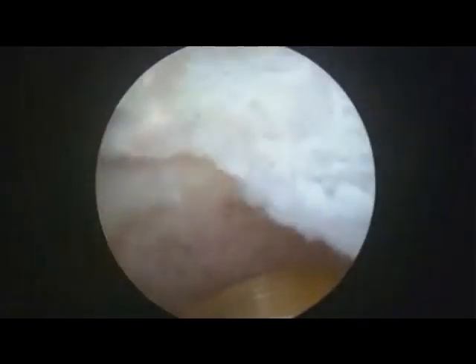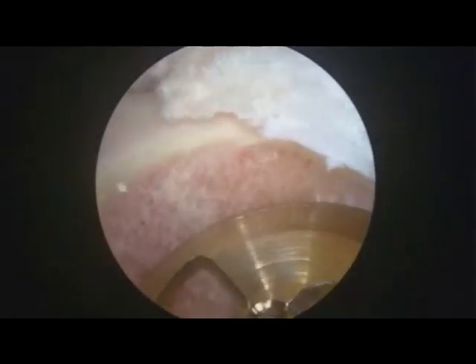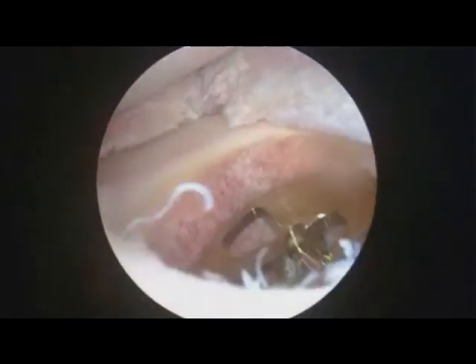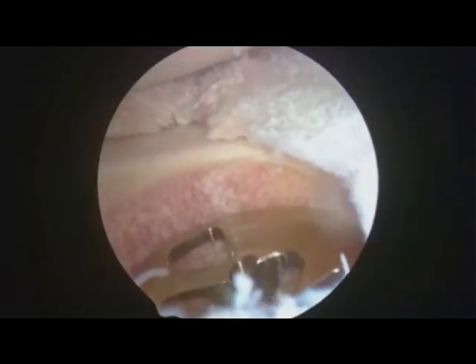You can see the meniscus is just a little bit frayed, but it's still intact, and the whole purpose of this procedure is to be meniscus sparing, so you don't want to take any of that down at this point in time. Now, it's up to you if you want to put the final implant in now or not. I'm just going to show it to you so that you can understand the technique, and then we'll go to the femoral side.